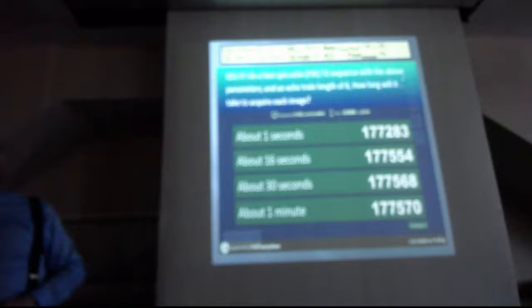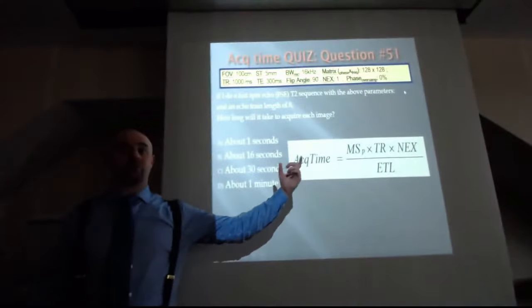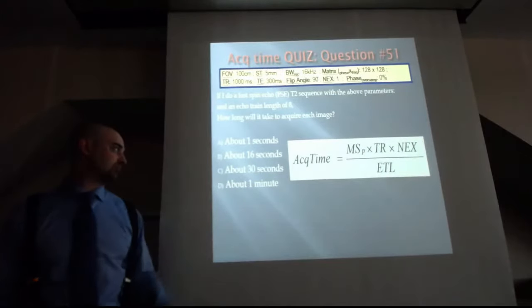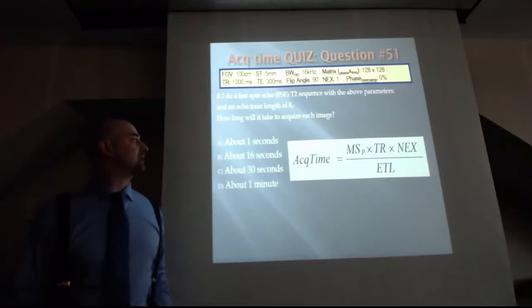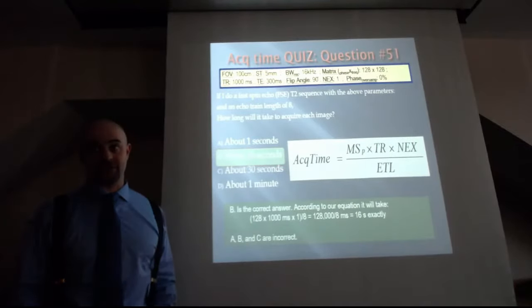Yes, 100% got it. Very good. So about 16 seconds. It's the same as last time, 2 minutes divided by the echo train length, 8. 2 minutes divided by 8 is about 16 seconds. Very good. I'm sorry, 16 seconds exactly.